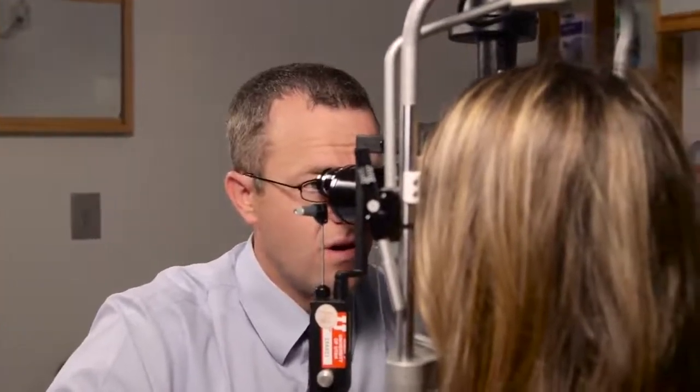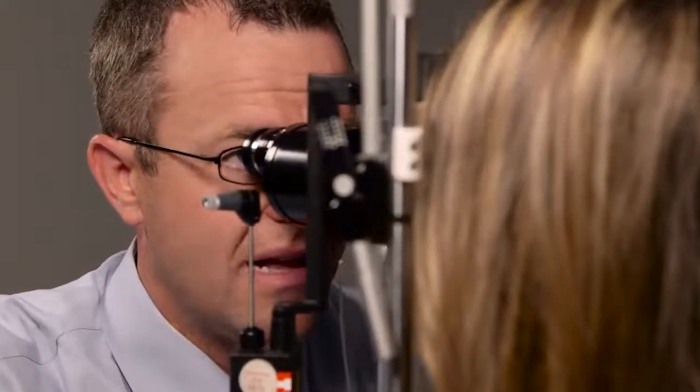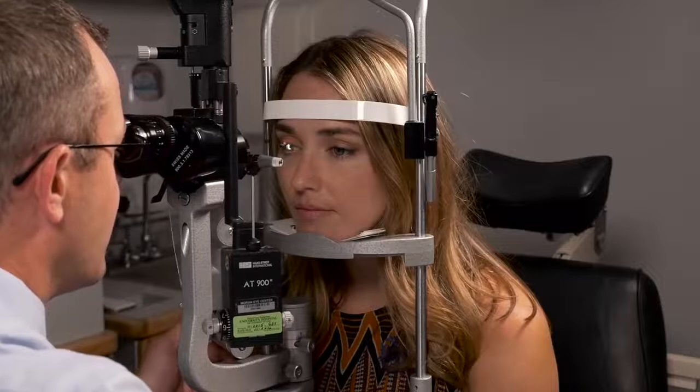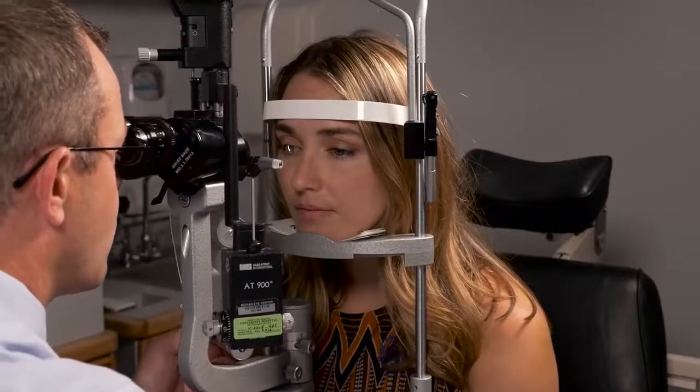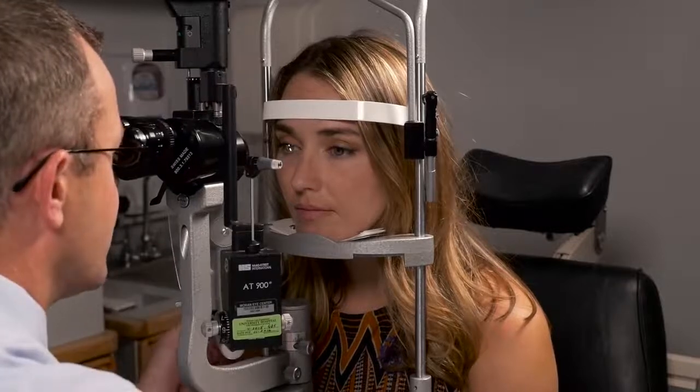So I'm just going to start her exam on her right eye. I start out by looking at her eyelids, and then I look at the conjunctiva and then the cornea. When you come to your cornea exam, that'll be a time where you start to narrow the beam.